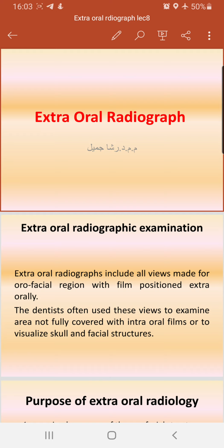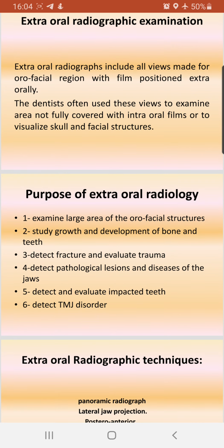Extraoral radiograph examination includes all views made for the orofacial region with the film positioned extraorally. The dentist often uses these views to examine areas not fully covered by intraoral film or to visualize the skull and facial structure. Purpose of extraoral radiology.